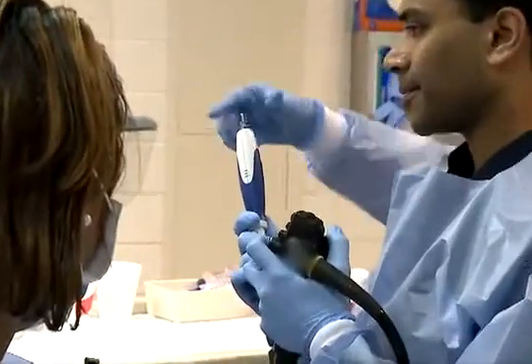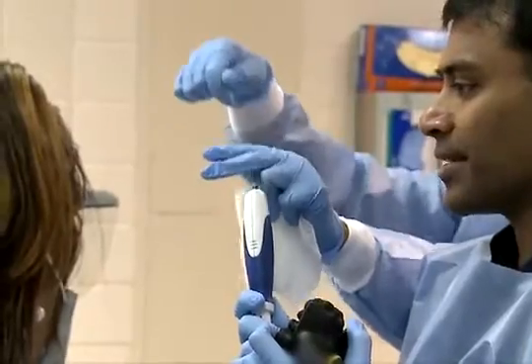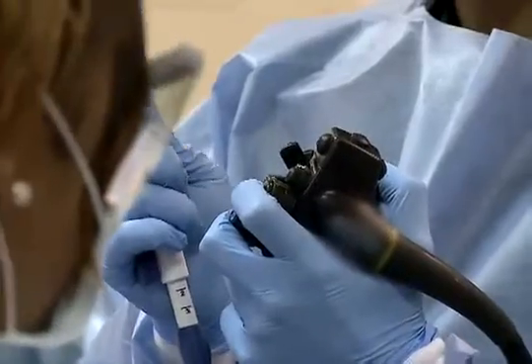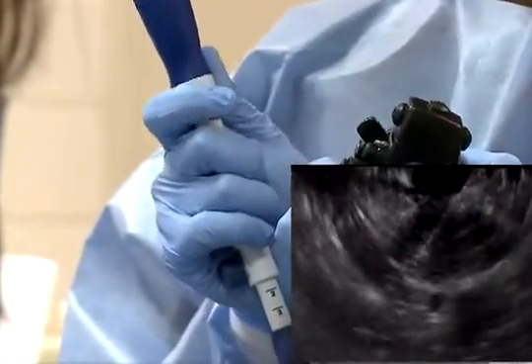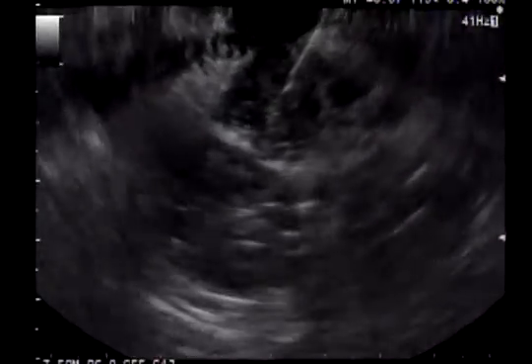I pull the stylet out. And once your assistant removes the stylet, you go back into the mass lesion close to 6 to 10 times to procure tissue. And all that I do here is to move my thumb back and forth. I go into the lesion back and forth, and this can be visualized on EUS imaging continuously and in real time. Once you do about 10 passes within the mass lesion, you withdraw the needle and you express the specimen to your slide, which we will do very shortly.